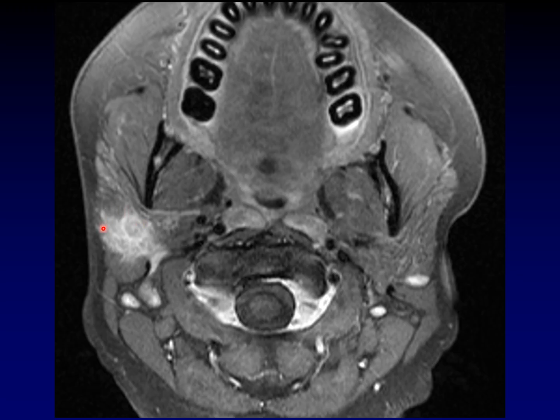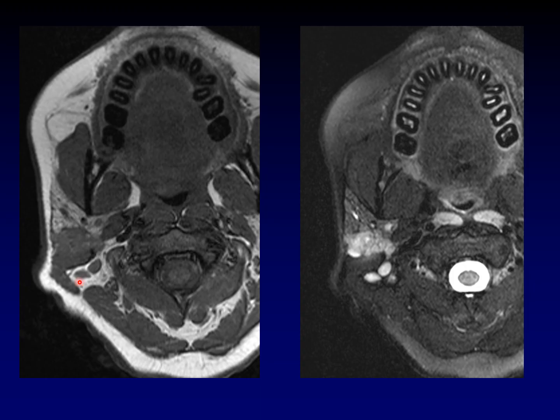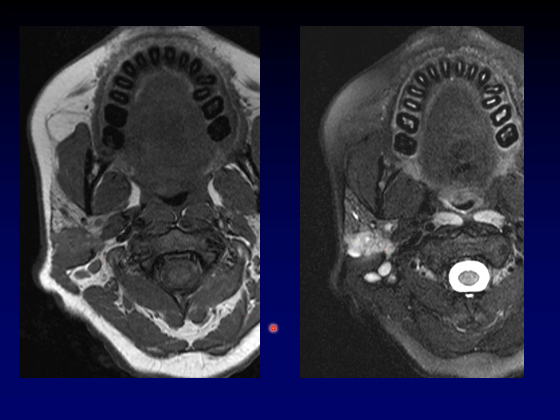Look at how irregular the margins are, with strands of enhancement extending away from the mass. It maybe looks a little more well-defined on the T1-weighted image. The T2-weighted image is bright, which is a little reassuring. A dark T2 would be a bad sign, usually indicating high cellular density for malignancies, but still overall a very concerning appearance.